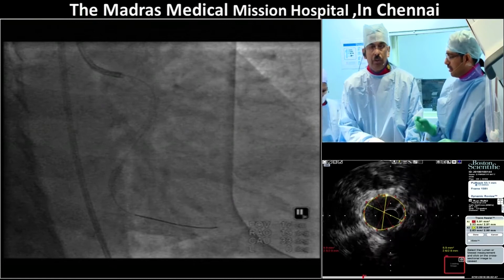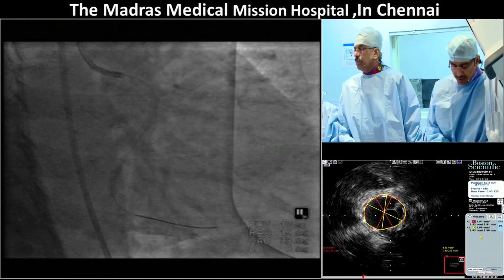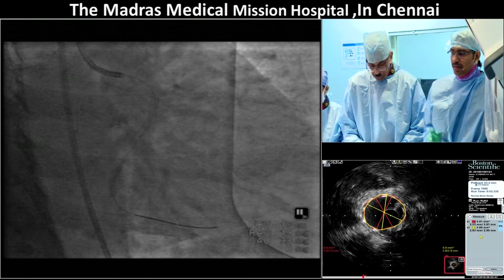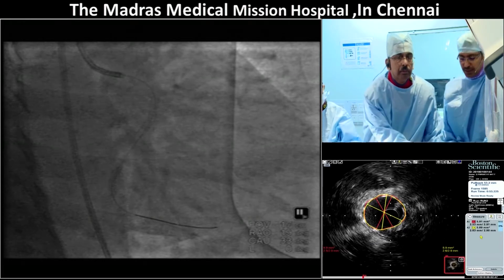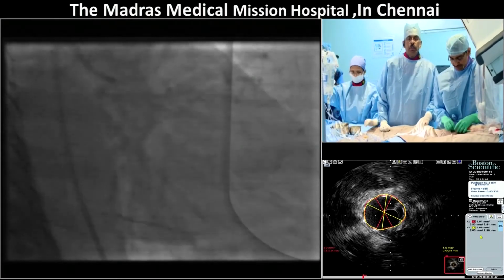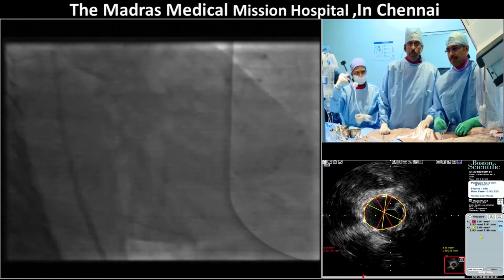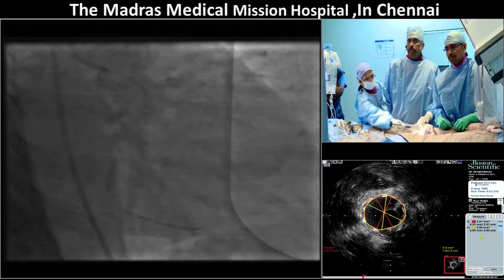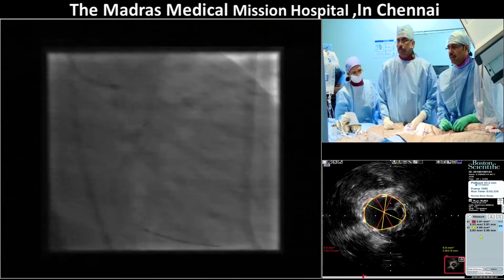Okay, so if you're all happy with that, we had to dilate a little bit the proximal part with a 3 millimeter balloon. We are just optimizing the proximal part of the stent with a 3.0 balloon. We measured it, the malapposition comes around 2 to 2.5 millimeters in length. So again, we have to treat malapposition very judiciously. As you know, malapposition has not much in the way of acute events, and unless it is under-deployment with malapposition, you won't have a problem.